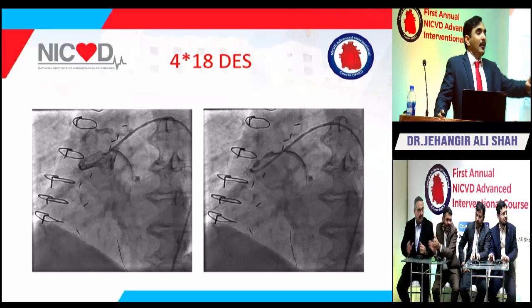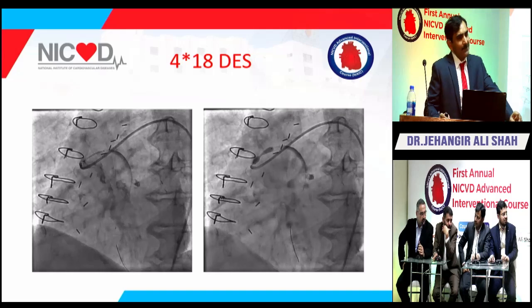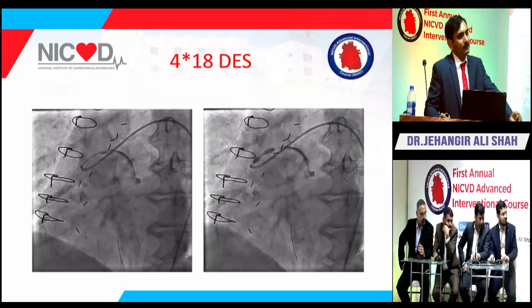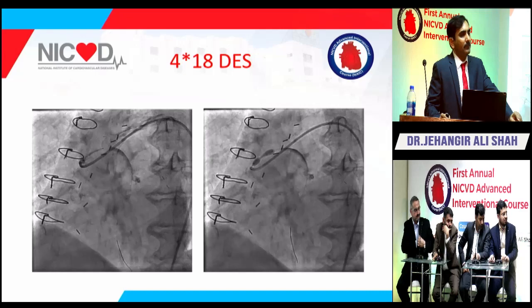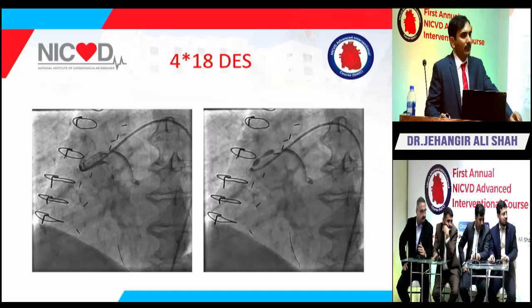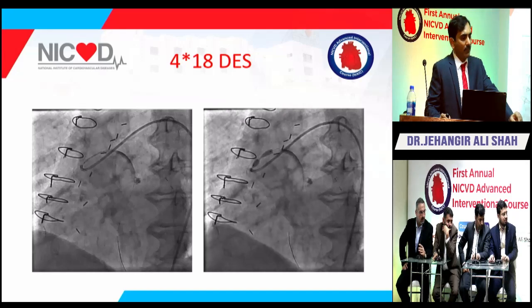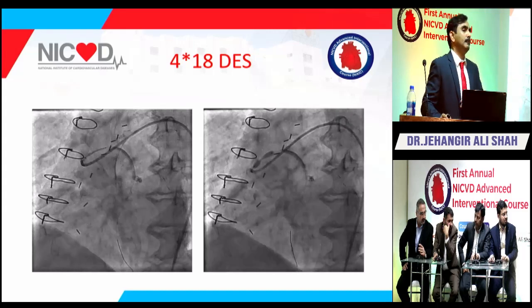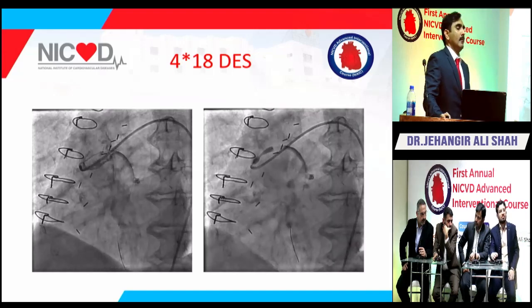Okay. Very good point, because you just cannot see the ostium of vein grafts they're coming from. If this is more difficult to do because, say, you've got an AL guide and you can't do that, the simplest thing is to take a guide liner and do the same thing. With the guide liner, advance it till the waveform dampens, and then gradually keep pulling it back and adjust your stent accordingly. As soon as the pressure recovers, you know that's the true ostium. Pull the stent back another dot or two, and you will be pretty certain.